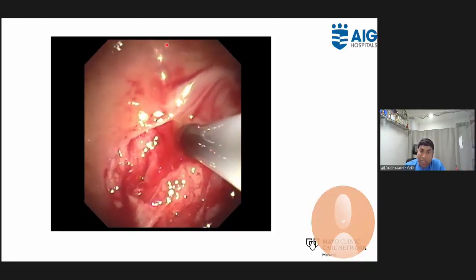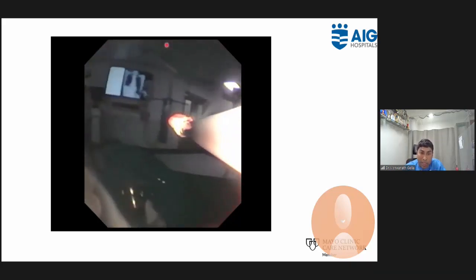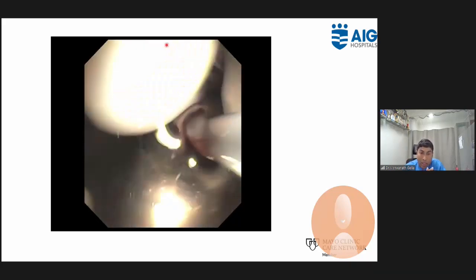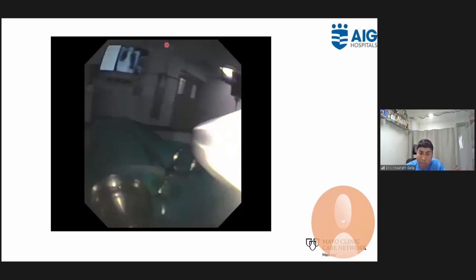And then what you have seen there is the cryopleural biopsies being thawed into normal saline. So you take the larger tissue biopsies, serial biopsies, 4 to 5 biopsies, and you thaw them into the saline. And then after that, this is transferred into the formalin within 5 to 10 minutes.